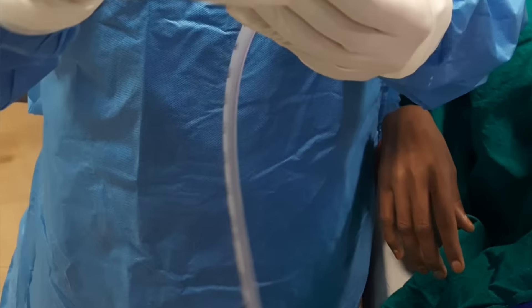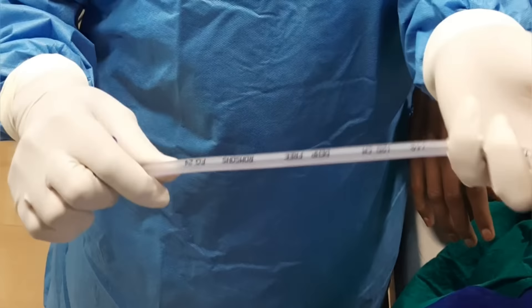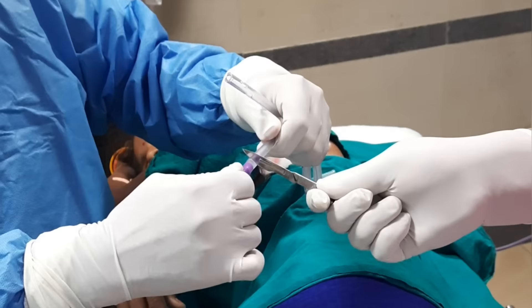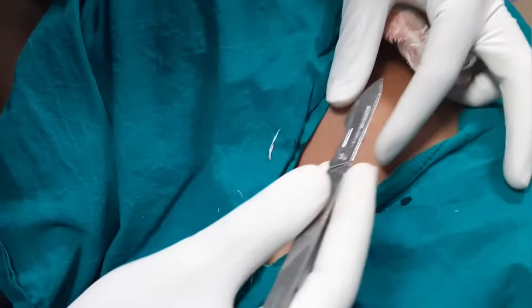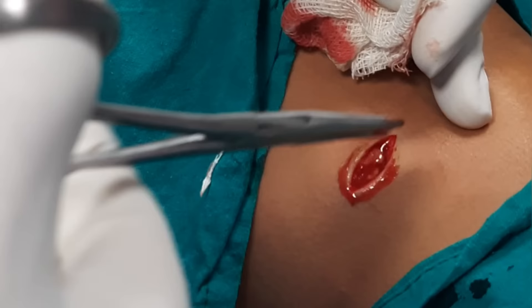This is a 24 French chest tube. It has 4 or 5 holes, and markings at 2, 4, 6, and 8 centimeters. This is the blind end. We will cut 2 additional holes. Note that 3 French equals 1 mm, so 24 French means 8 mm outer diameter. We will give an incision of around 1.5 centimeters — skin and subcutaneous incision only.